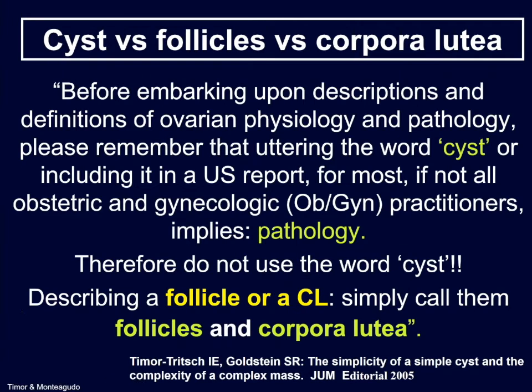And I also warn every time I give this lecture, before embarking upon descriptions and definitions of ovarian physiology and pathology, remember that saying the word cyst to the doctor or the patient, or including it in an ultrasound report, implies pathology for most, if not all, OB/GYN practitioners. Therefore, do not use the word cyst.